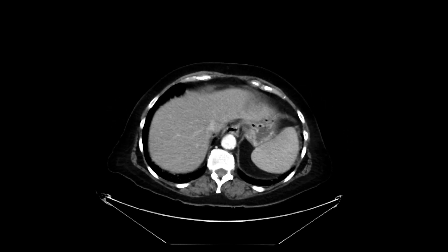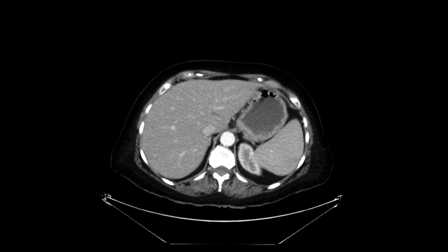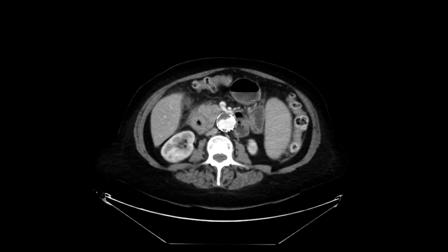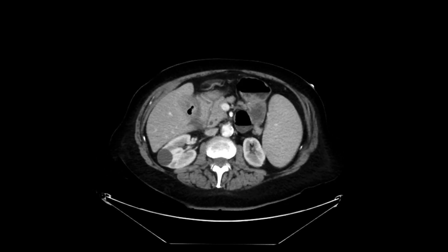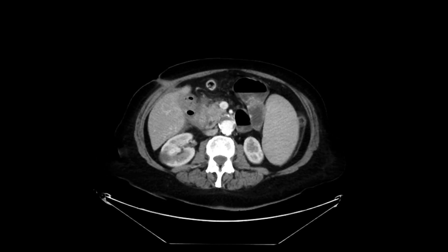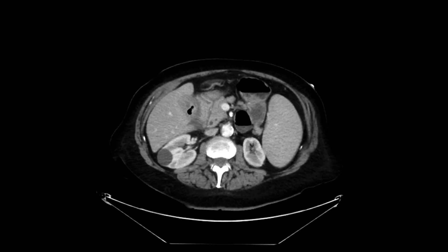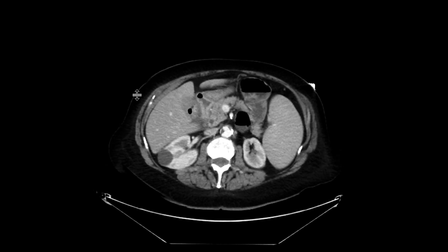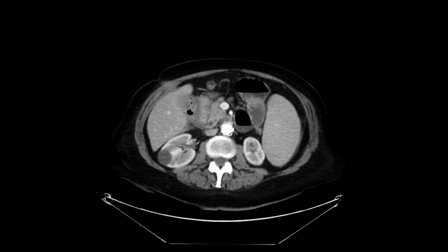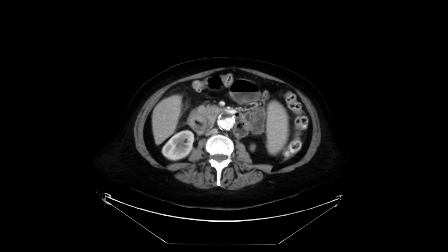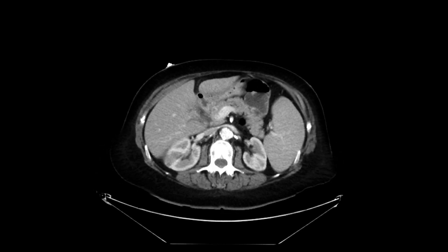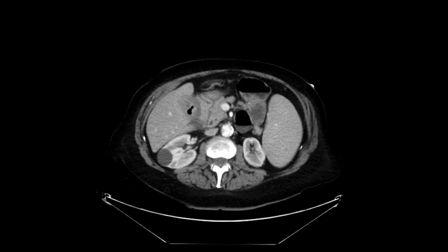As we can see scrolling downwards, in the right upper quadrant, there's an abnormality involved in the gallbladder. The gallbladder looks very abnormal — there's a thick wall, there's some inflammatory change, and there's foci of gas within it that appear to extend via a tract to the adjacent duodenum, second portion of the duodenum. So there's certainly something going wrong with the gallbladder.